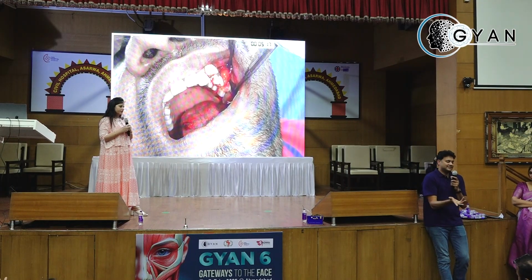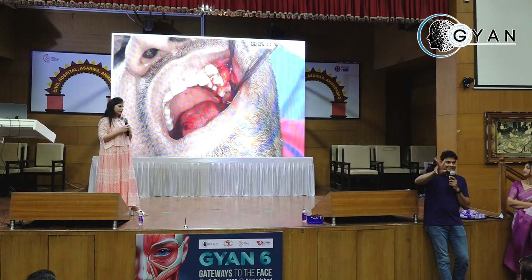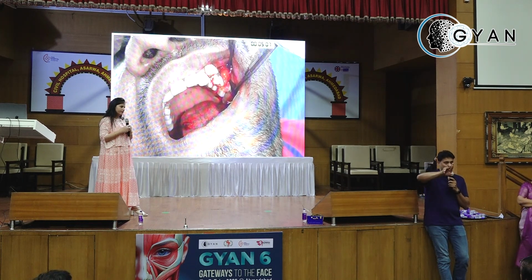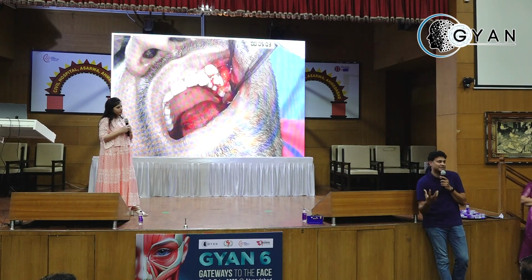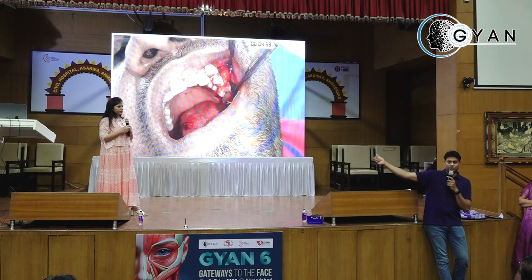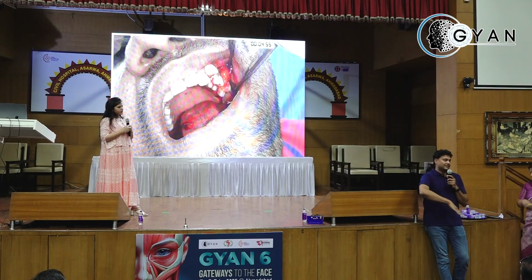Then it just has a layer of fat which gets atrophied very quickly. So when you are trying to get the fat, dissect around the fat. As soon as you see the fat, dissect around it, keep opening up, and the fat will prolapse. Once the fat prolapses into the oral cavity, it is passive. You can stitch it up to fix an oroantral fistula, or you can take it towards the midline in the cleft palate patient.